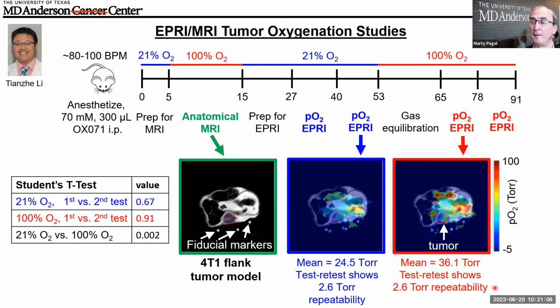And in fact, as you may recall on a previous slide, I showed that MRI precision can be at best 15 to 20% for a lot of our common measurements, sometimes as bad as 40 or 50% imprecision. And I find that frustrating in small animal imaging. Here we've got test-retest repeatability showing that it's on the order of about 10% of the PO2 measurement.